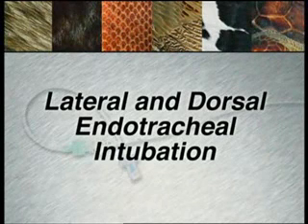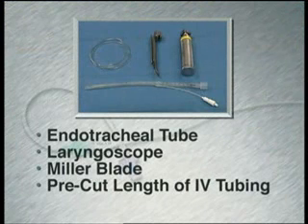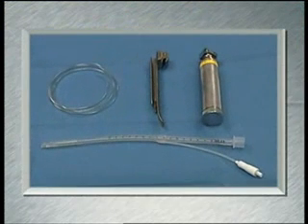Lateral and dorsal endotracheal intubation, as indicated in critical patients, can be done by one individual. Dorsal intubation allows for placement of a tube one size larger than normal. Supplies include an endotracheal tube, a laryngoscope with a Miller blade, and a pre-cut length of IV tubing.